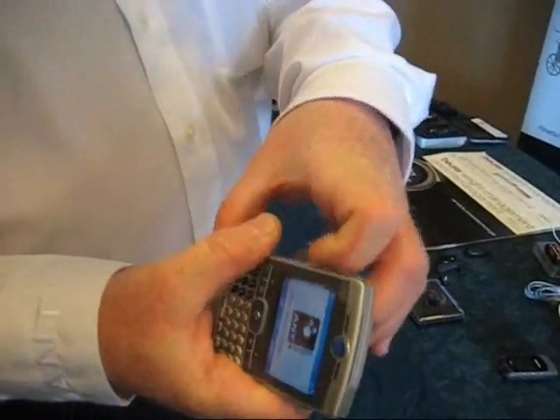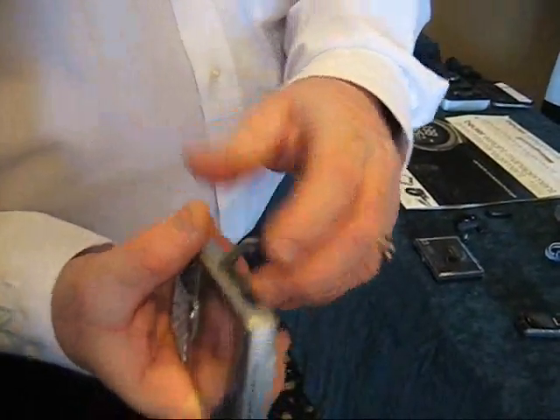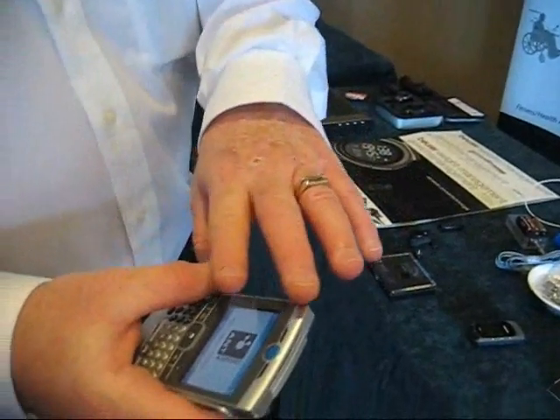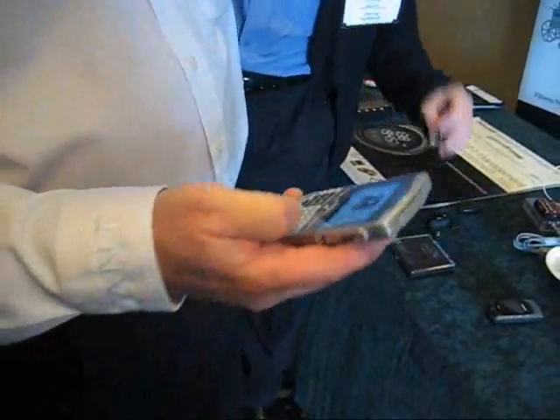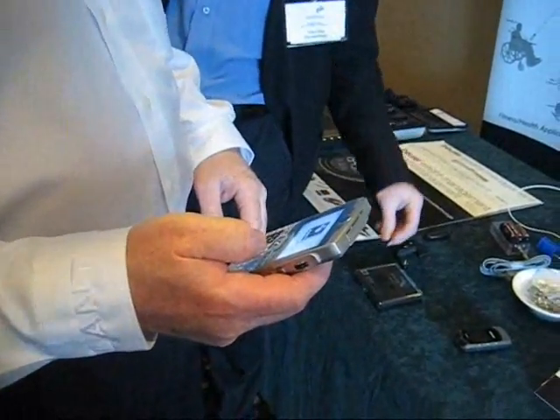We just stick it inside the Motorola Q-Foam. This SDIO card works with a Windows CE platform, so this has a Windows CE platform, and then we've created an application.